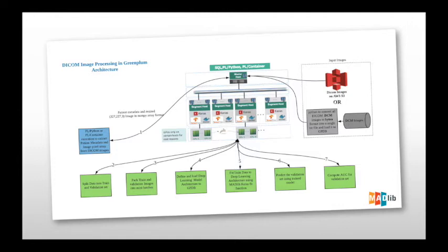If the images are, let's say, 20,000 or something like that, not in millions, then they can reside on the master node itself. But you can have them on a drive which is network connected to the Greenplum master node. Or you can completely put them on a cloud S3, I mean AWS S3 server.